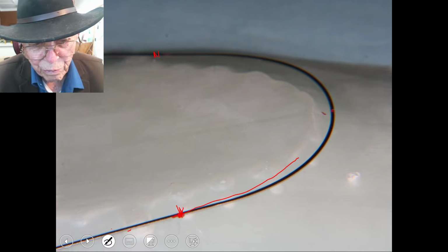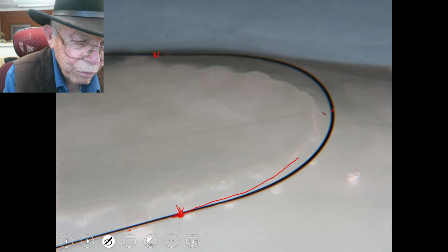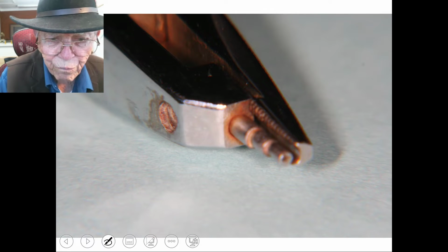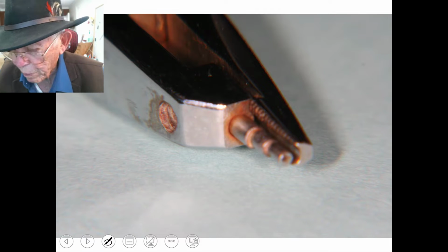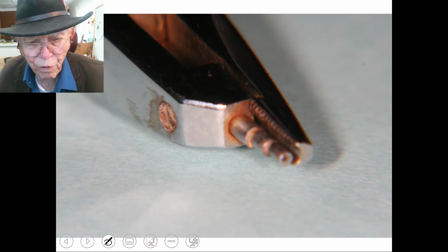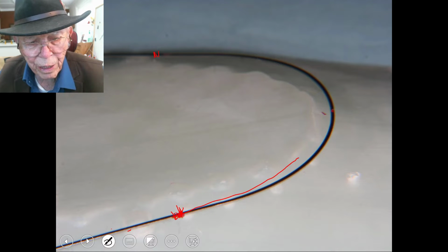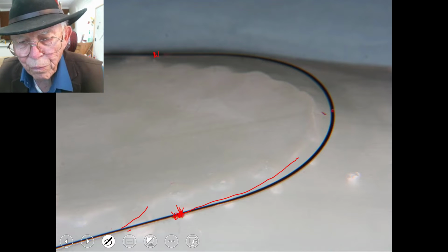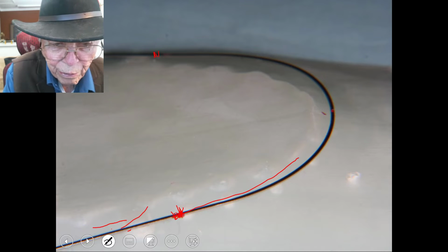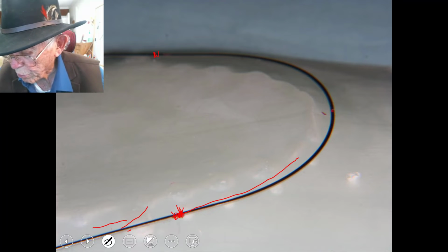Now, that mark, you've bent this before, and you put your plier at a certain distance from the mark you want, and as you bend it, the wire is being used up from the tail end of it. It's used up on the far end of the wire, down here. In other words, it doesn't use the archwire from here to bend this loop. It uses this portion right here, which doesn't bother you. You can clip that off when you get through.